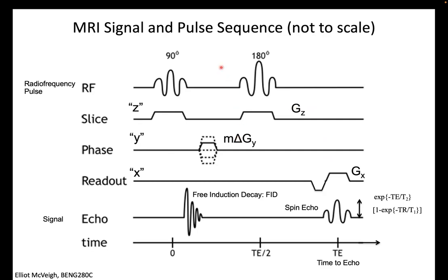So that is the quintessential, simplest MRI pulse sequence you can think of. And pulse sequence programming languages were designed by each manufacturer such that you as a research person could swap this out for whatever you wanted. You could make this thing do, within reason, virtually anything. And it became a huge cottage industry. It was just creating new pulse sequences that created different contrast.